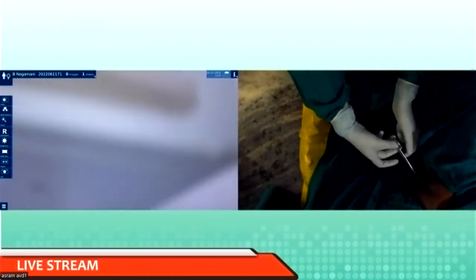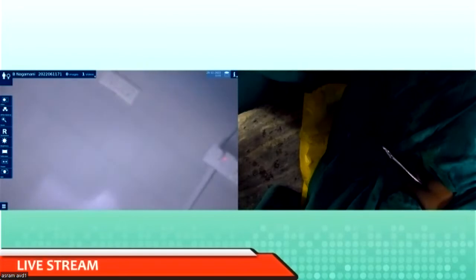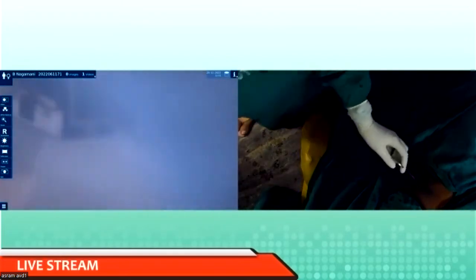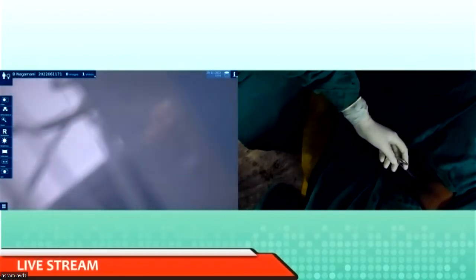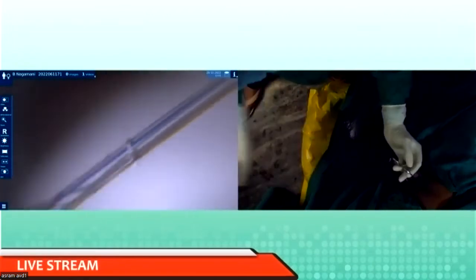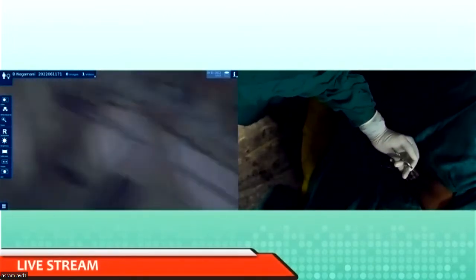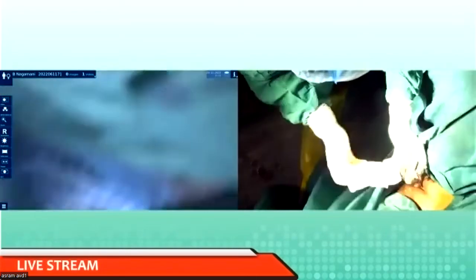This is what I was trying to tell you. For a beginner, I always tell them to touch the fundus and come back. Okay, sir. When you do about 100, 150 surgeries, you get the orientation. Gentle curettage, madam. When you get the experience, you go prospectively. Now look at the previous one. It had bleeding. The moment you put in a dilator, it bleeds. That's true, sir. The moment you don't put in a dilator, you'll have difficulty. But if you have a 4 mm scope, without necessary dilatation, it will go.